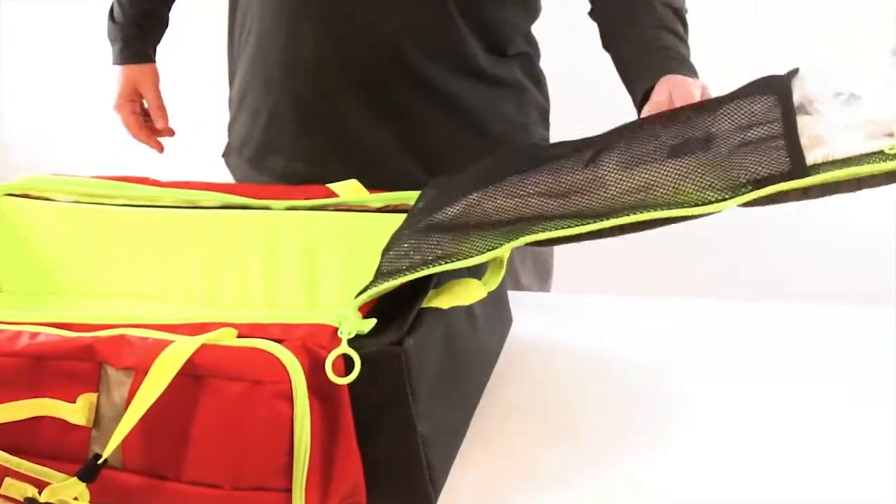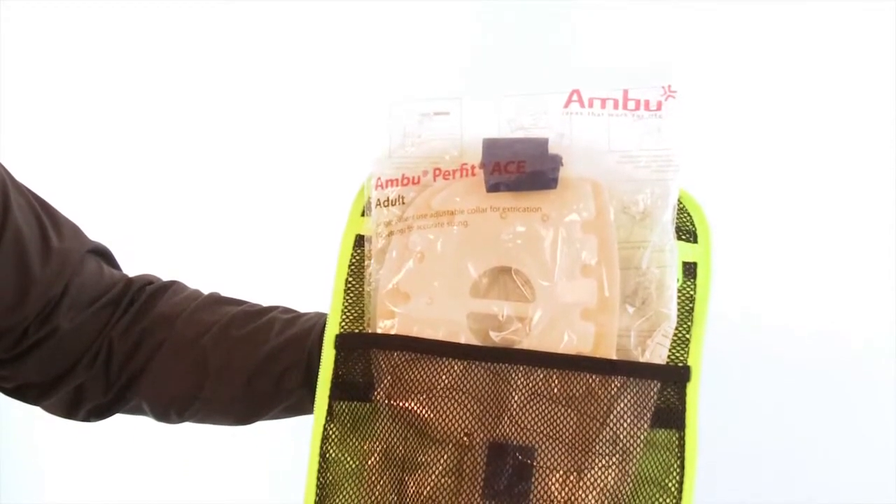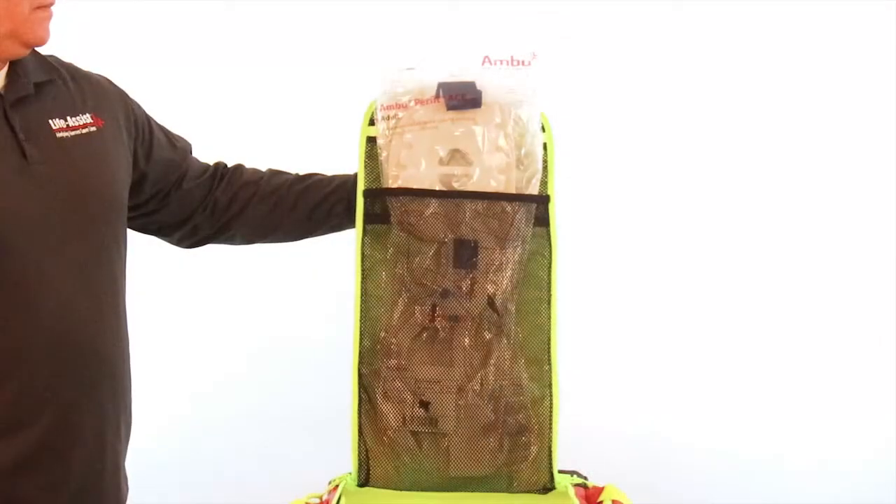Last, and certainly not least, there is an inside mesh pocket located in the main compartment, large enough to fit cervical collars with ease.